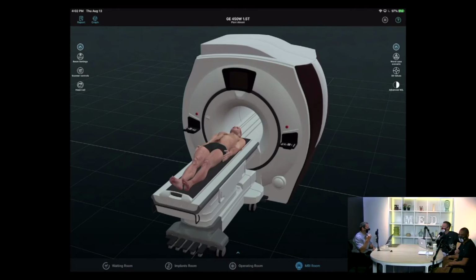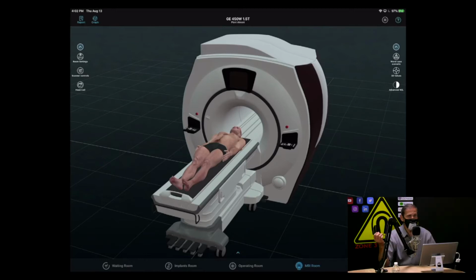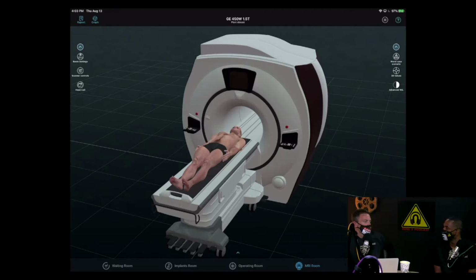And I feel like you've thought of everything with this one. It's nice. Well, it's not me that's thought of everything, because you have to remember who I'm asking to help me define what we need. I'm asking technologists. I'm asking radiologists. I'm asking physicists. There are parts of this app that are specifically designed for the physicist, parts specifically designed for the radiologist, and the majority of the user interface is designed for the technologist. So it's the feedback from the end users that helps us determine how we created the interface.